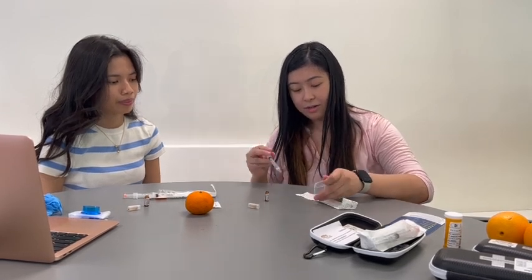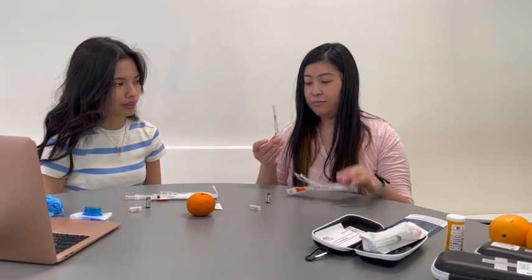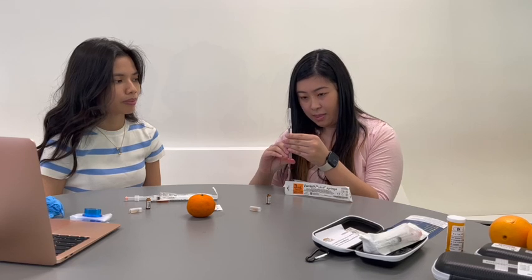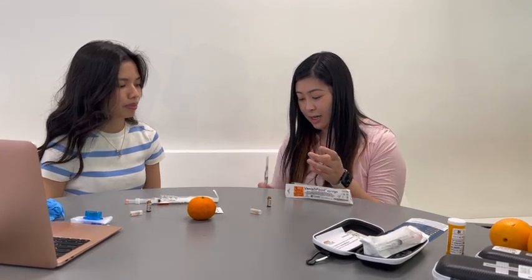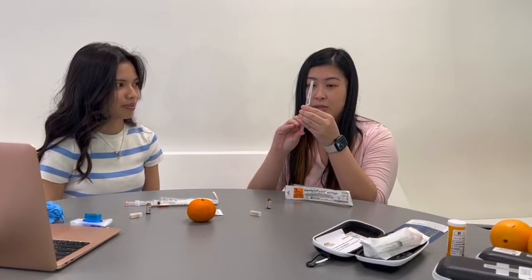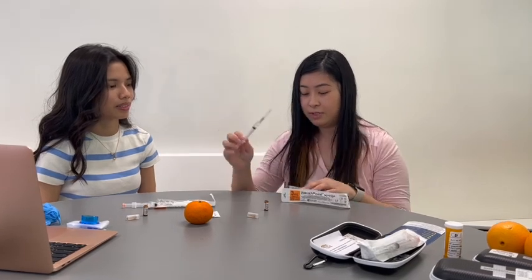So then I would cap it back on like you said. Yes. And then with the air, I would just push it out. And then if there's any air bubbles, which I see, you said to just tap it to get it out. And then once those bubbles are out, just push it out with the syringe as well. Okay, I believe this one's ready to go.